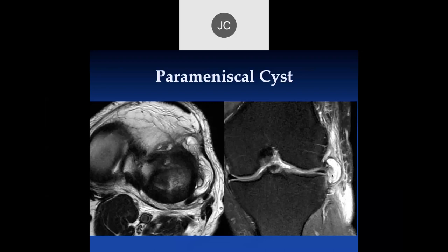In this location, these are tears. There was some debate a number of years ago about what these were, but these are just a residual of a tear of the meniscus.